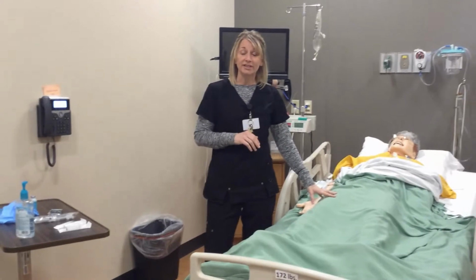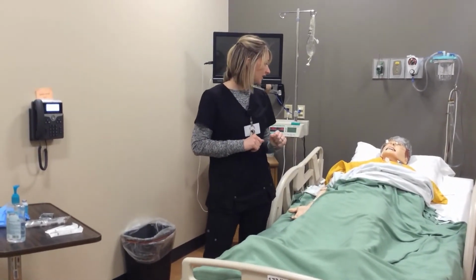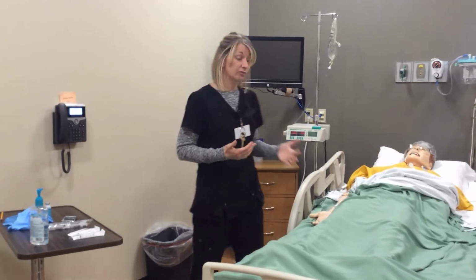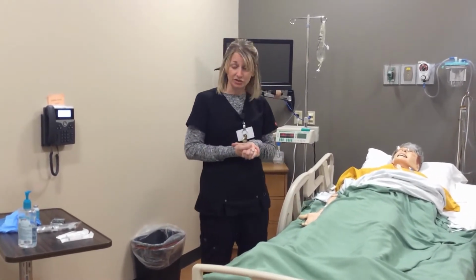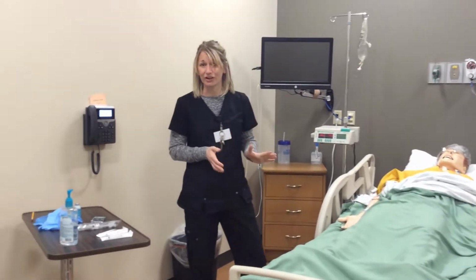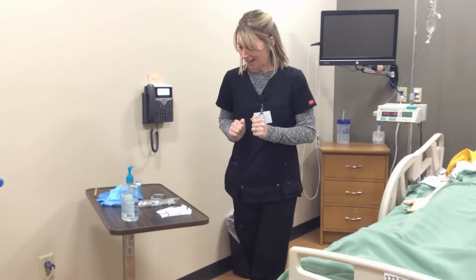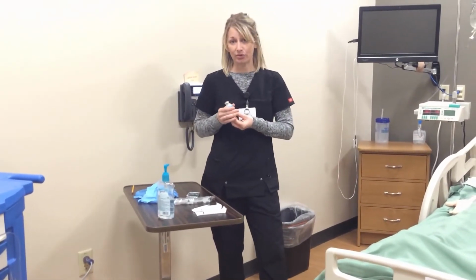I'm going to do the appropriate assessment of my patient beforehand. I'm going to educate my patient to the medication as far as what kind of effects they may be able to expect from it, what kind of result we are going to go after with giving the medication administration, so the reason why, as well as the patient has a right to refuse. I'm going to look at all of their allergies, making sure that the medication I'm going to give is not on that allergy list. I'm going to also check the expiration date on my medications as I pull them.